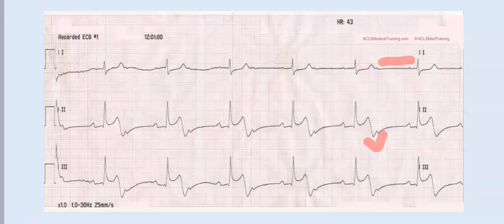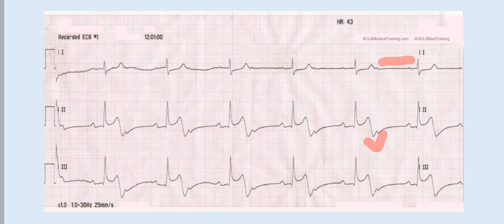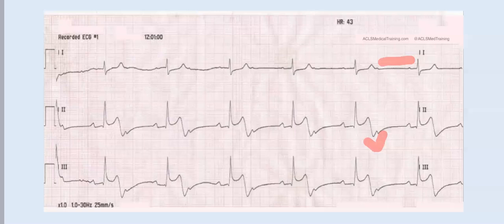Because it is assumed that the posterior aspect of the heart is heavily populated by vagus innervation. And the vagus, when stimulated, leads to abdominal symptoms and to blocks of various forms. That's why the presentation of the posterior is sometimes difficult and its ECG is sometimes dramatic.